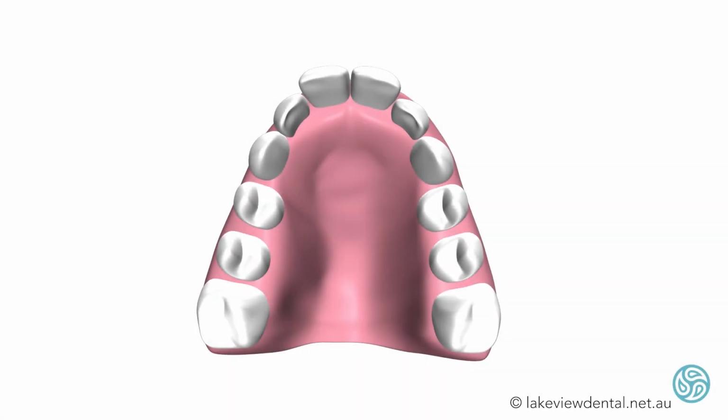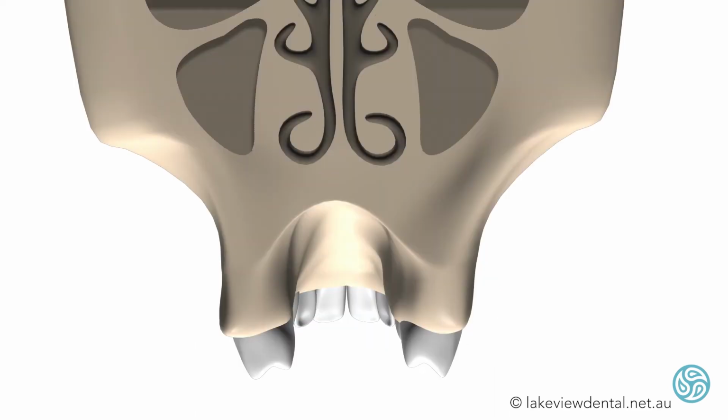The process of developing upper jaws with the use of an anterior guided growth appliance. Pre-treatment jaws requiring development include narrow dental arches, narrow and high roof of the mouth or palate, underdeveloped upper jaw or maxilla. Narrow and high palatal arches may be linked to restricted nasal passages.